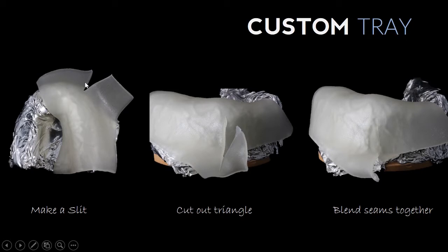Last little tip is when you're using this Triad material, it's not perfectly shaped to the arch, so we're going to have to cut it and use several pieces to make a tray that's going to be well adapted to our typodont.